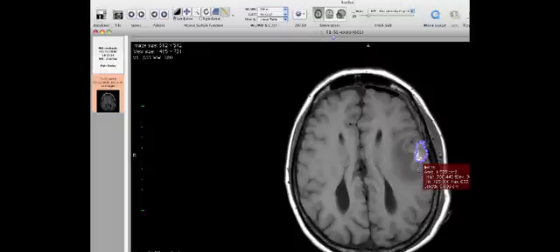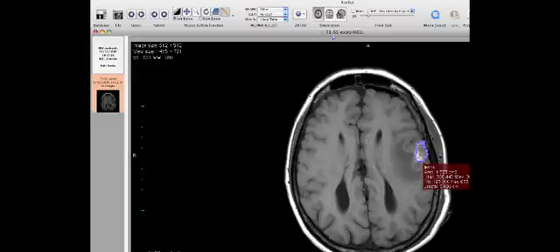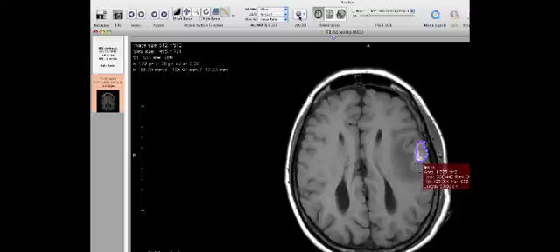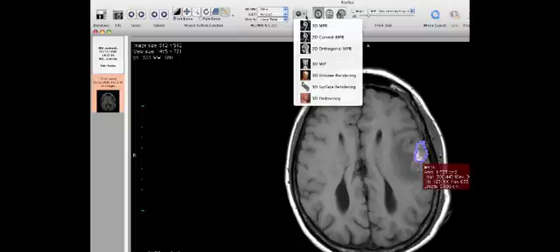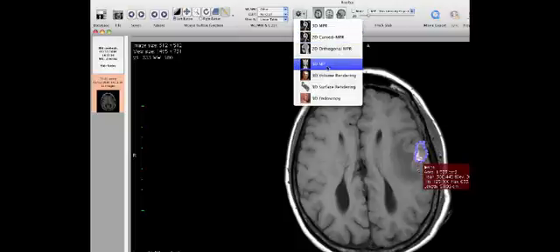But that is not good enough for us. What we wanted to do was create a 3D image of the lesion and then see how it's related to the rest of the brain. So to do that you need to go to this button which looks like what we call a gear icon and click on the 3D MIP.